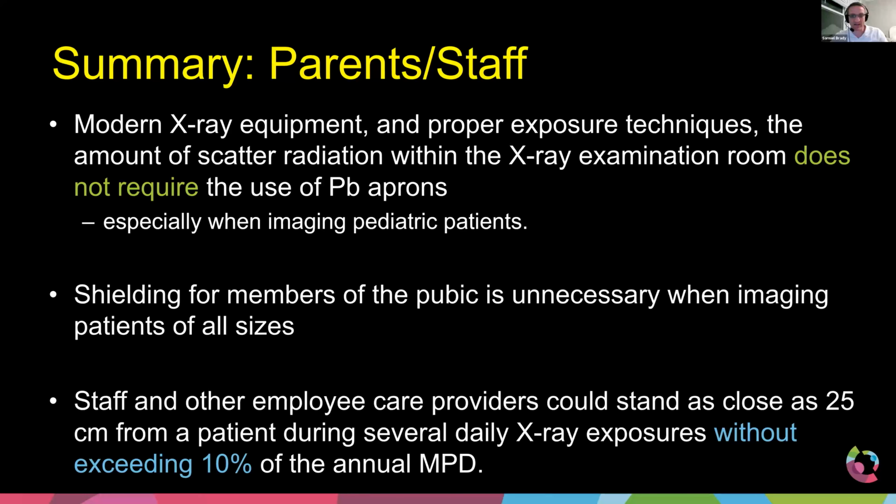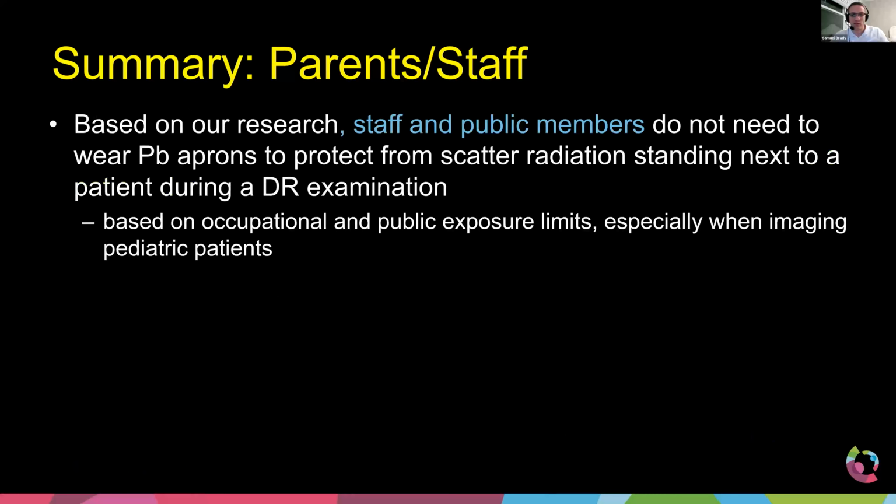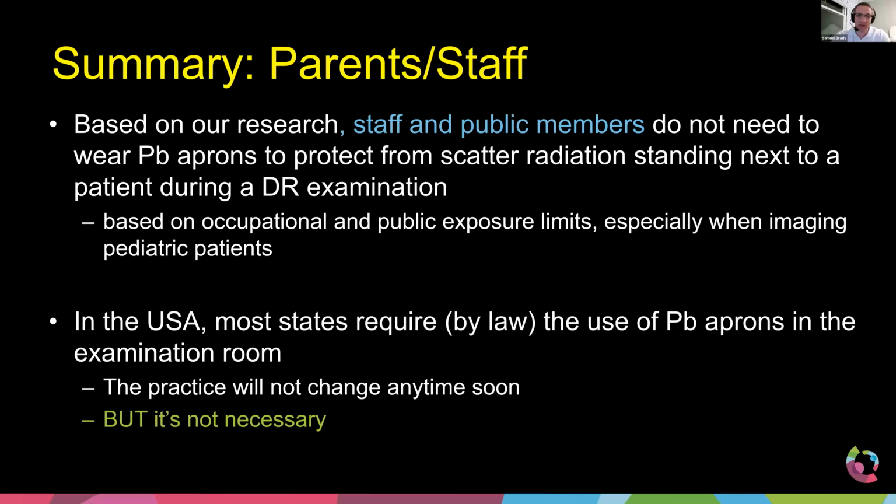That said, I need to just say this: in the US, we have a law that says if you're in the room, you have to wear lead shielding. It's quite literally written in as a law. And so even though we did this study and we did all these calculations, we did this to demonstrate that this law is really unnecessary. And maybe in the future, it'll go away.